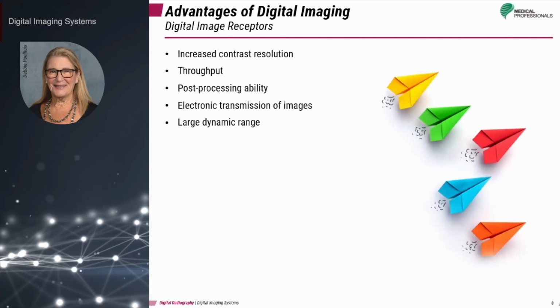And finally, digital images have a wider dynamic range because they exhibit a linear response to X-ray exposure. A relatively large number of exposure values can be used to produce a diagnostic image. These advantages will be explained in greater detail throughout the series.